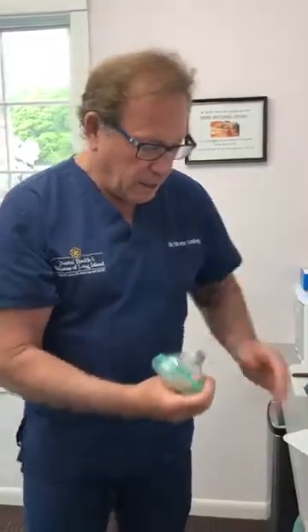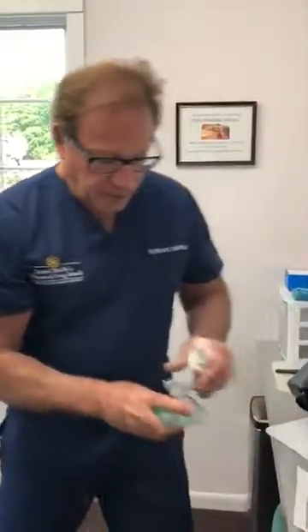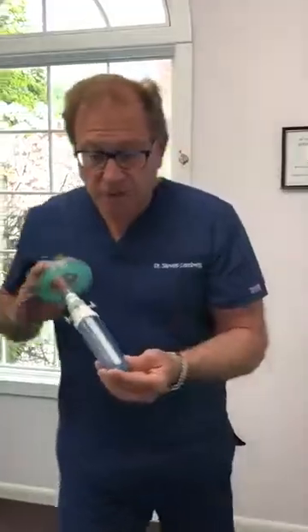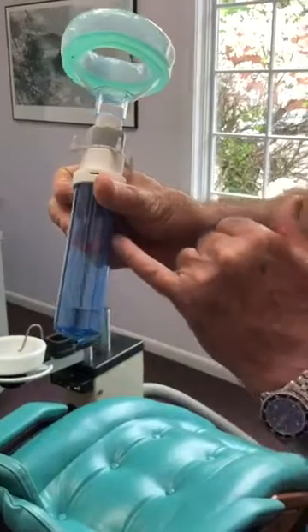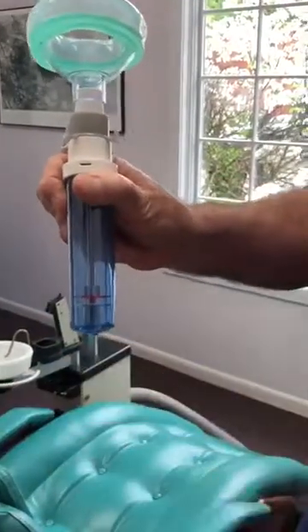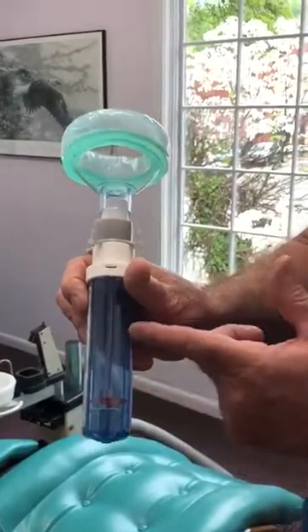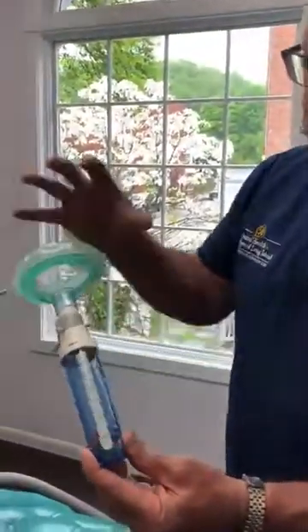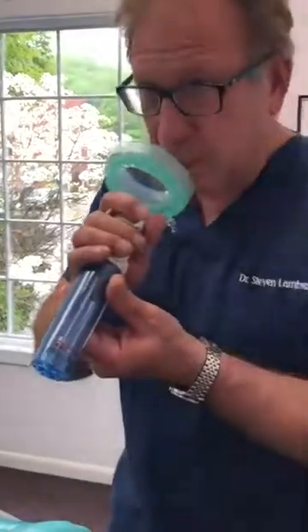These masks are disposable and cost about five dollars each. You take it out of the package, open up your In Check device, and put it on like that. If you get a close-up, it shows liters per minute. There's a little weight and a red wheel that goes all the way down — you do a quick inspiration and see where it ends up. You want to be over 100 liters per minute.